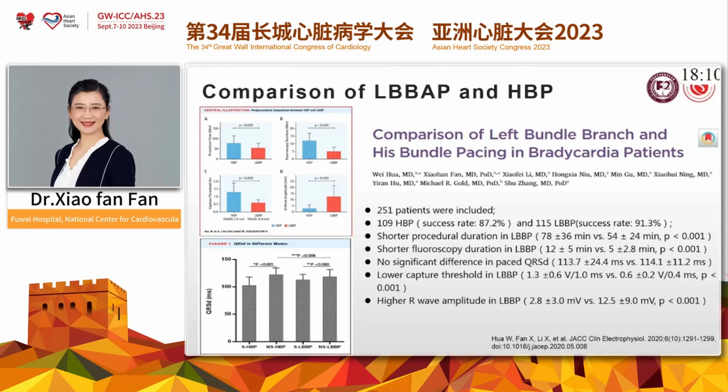Three years ago, our team first compared the pacing parameters of LBBAP and HBP. In that study, we found LBBAP has a high success rate, comparable with HBP. With more familiarity and more practice of LBBP, the success rate of LBBAP has increased now.